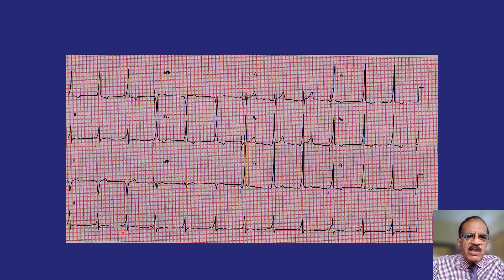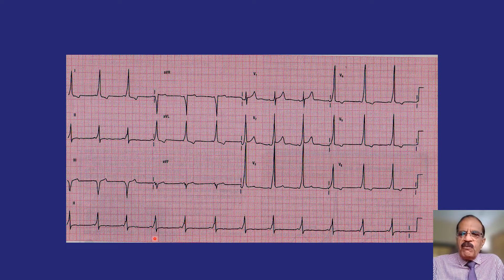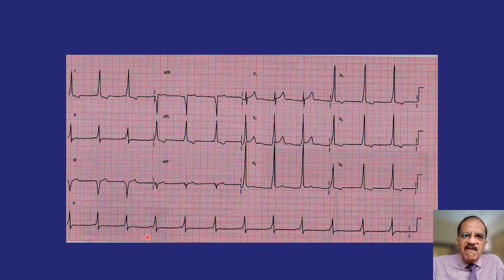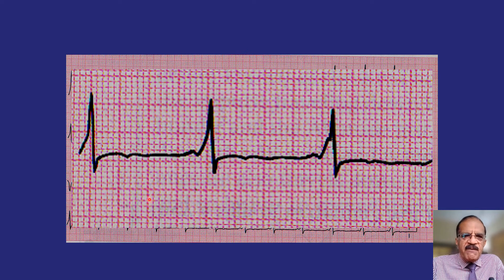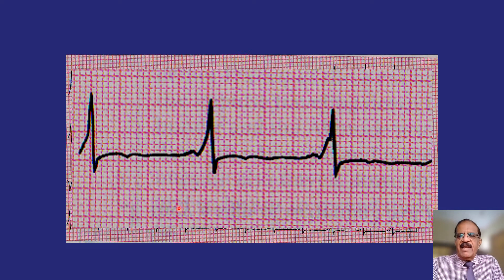Focus on this portion: there is a P wave followed by hardly any PR interval, and immediately the QRS starts with a very different morphology — as if some additional wave has been added to the initial part of the QRS complex. In a normal QRS complex the PR interval would be here, and QRS would start normally; but in this case an extra wave appears to have been added.